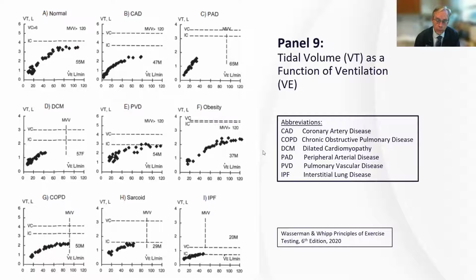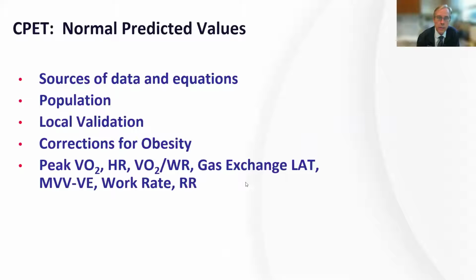So this is a visual way to look at it. Of course, you're going to print out your data and take a look at that too. But it also, I think, gives you a montage to look at, so that when you see these things, it's almost like a fingerprint. You can see that this is this particular type of disease. And these are the manifestations in each one of the panels that indicate that disease.